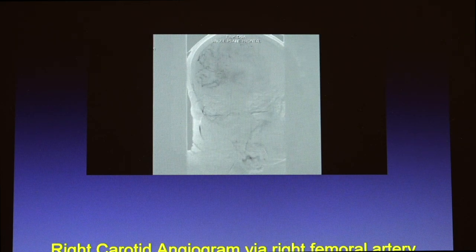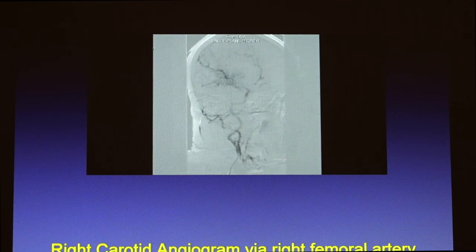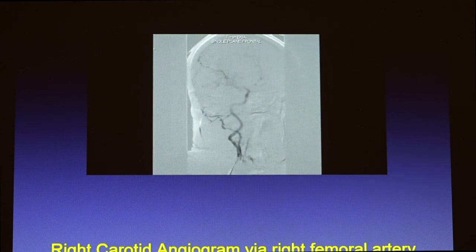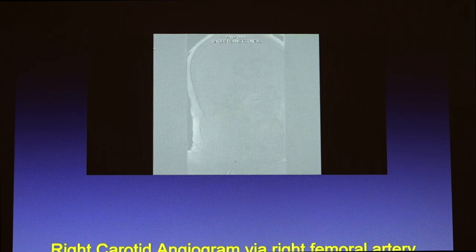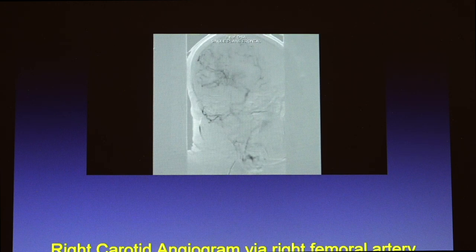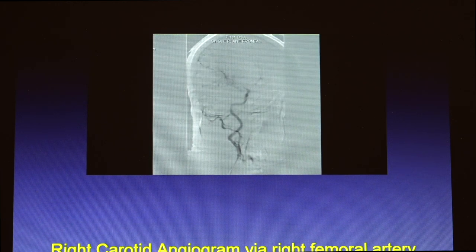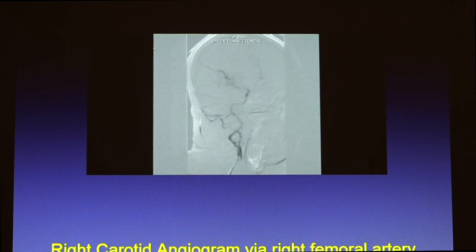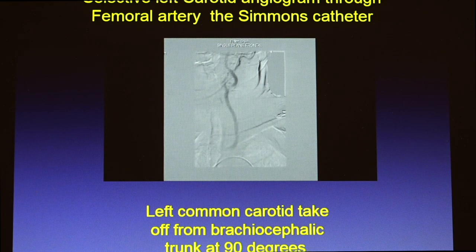We took pictures of the right carotid artery. You can see most of the filling of the right hemisphere and also some of the left hemisphere filling was happening from the right carotid artery, suggesting the left carotid stenosis is severe and hemodynamically significant — there is preferential flow from the right to the left side. In those patients, the longer the catheter manipulation happens, the more you increase the risk of periprocedure stroke. We took one or two pictures of the left carotid artery using the Simmons catheter, but even with that, it was very difficult to access the artery and image quality was poor.